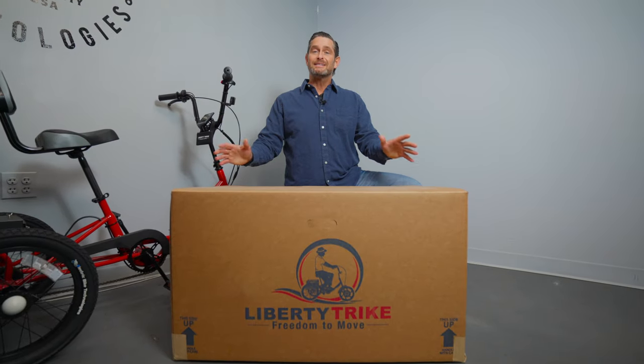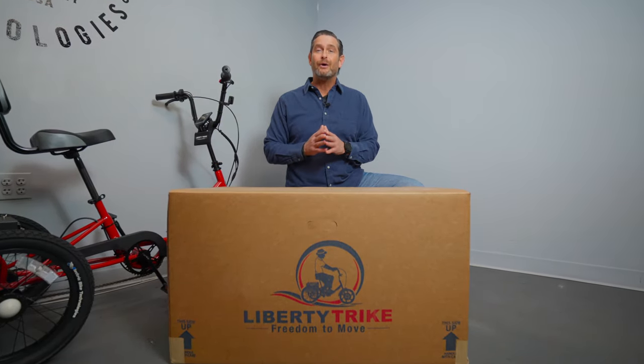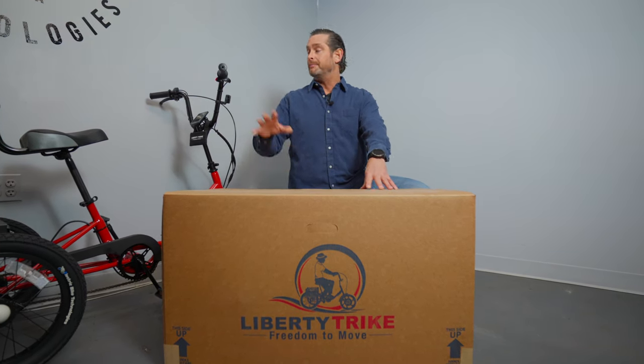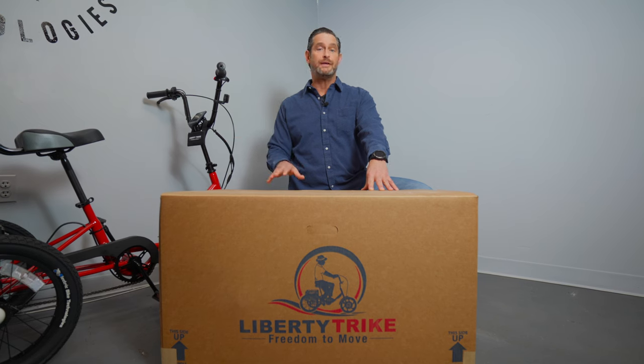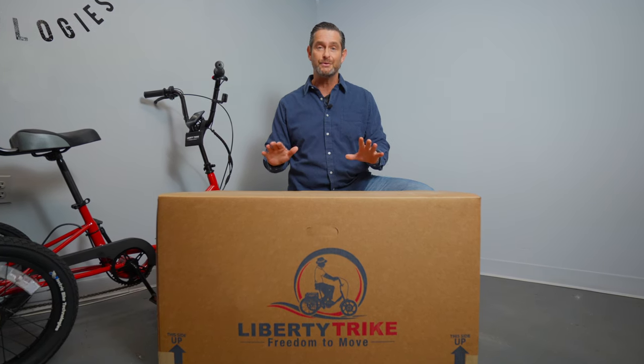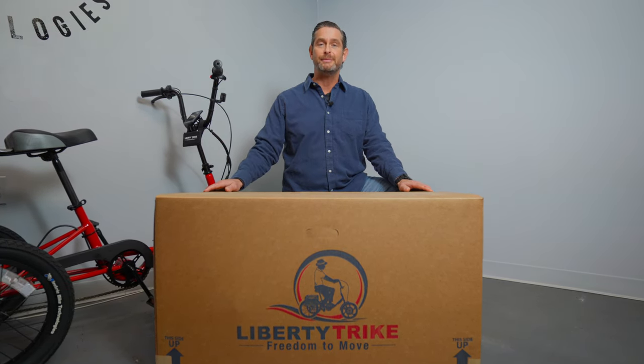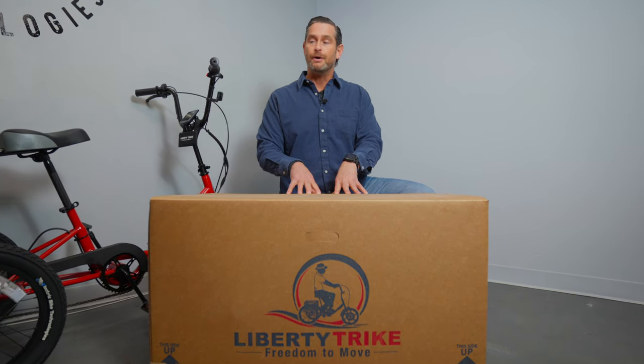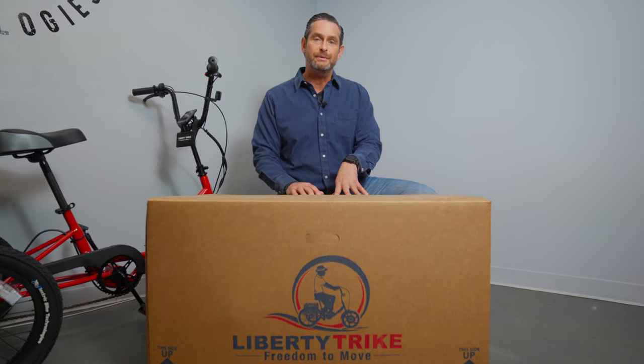Welcome to the Liberty Trike unboxing and assembly video. We're going to show you how easy it is to take your Liberty Trike out of the box once it's delivered and put it together yourself. You're going to need zero tools. The hardest thing about it will probably be taking all the packaging off that you see when we open this box. Let's get right into it.